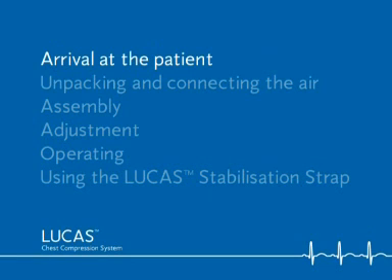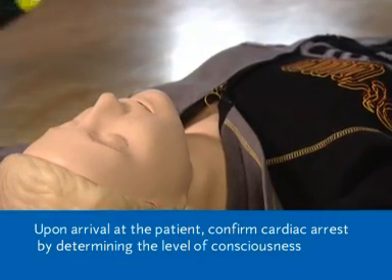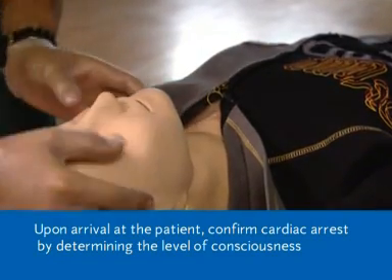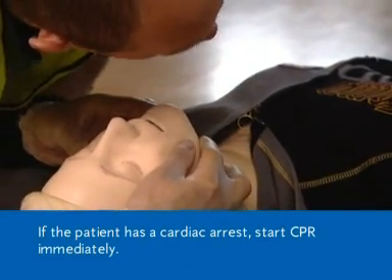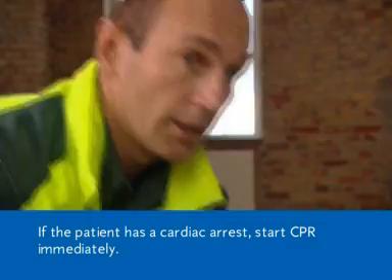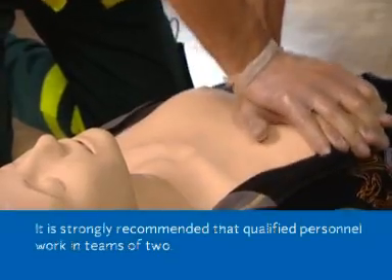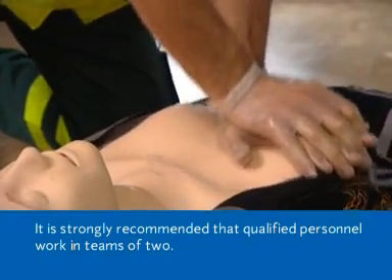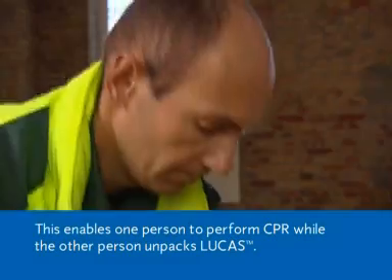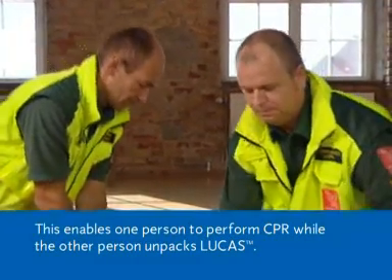Arrival at the patient. Upon arrival at the patient, confirm cardiac arrest by determining the level of consciousness, breathing and pulse. If the patient has a cardiac arrest, start CPR immediately. It is strongly recommended that qualified personnel work in teams of two. This enables one person to perform CPR while the other person unpacks Lucas.